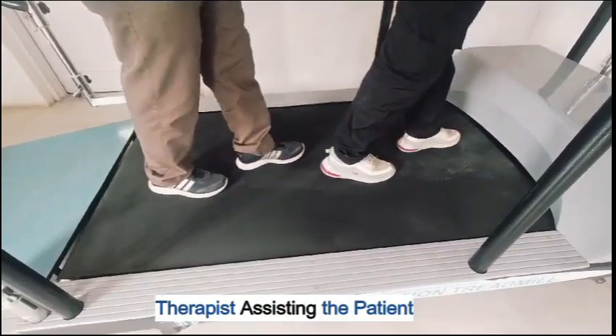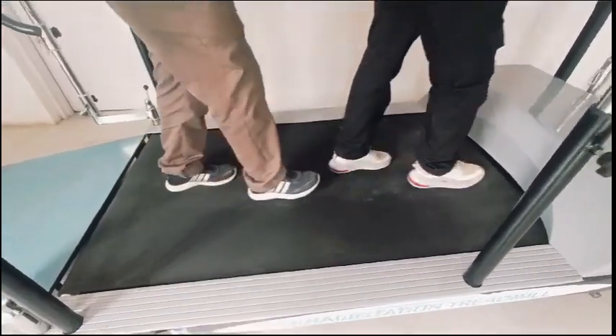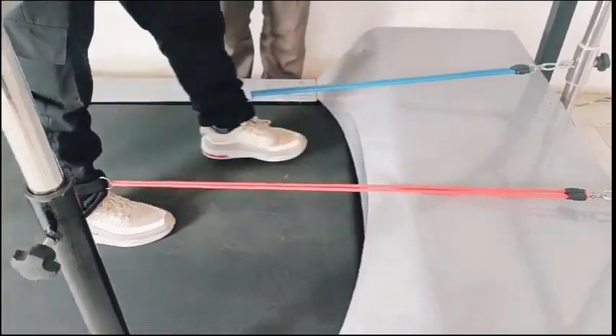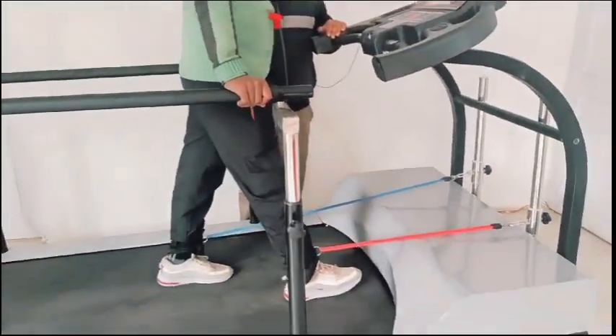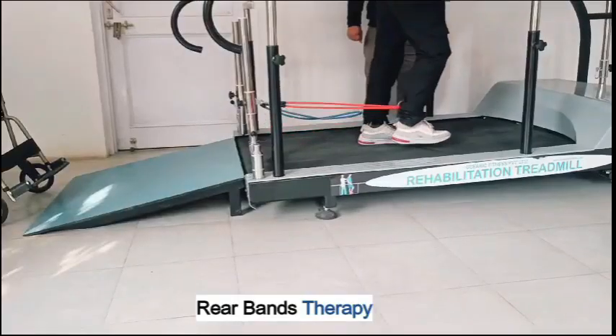The therapist assists the patient during exercise. Exercise bands are available for therapy, including rear band therapy options.